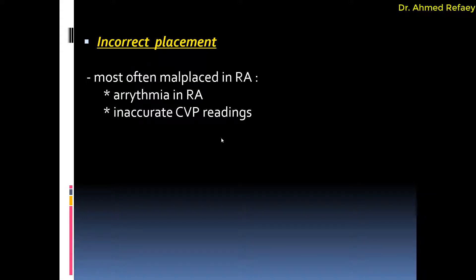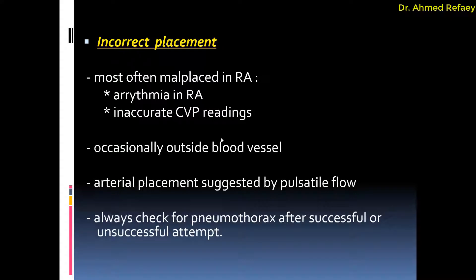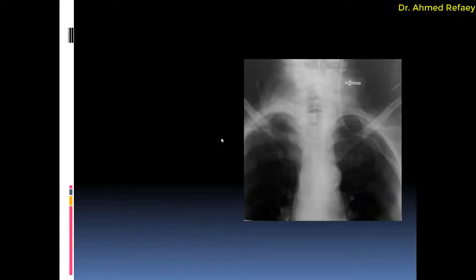Regarding incorrect placement of the central venous catheter: it is most often malpositioned in the right atrium, which can cause arrhythmia as well as inaccurate central venous pressure readings. Occasionally it is inserted outside the blood vessels. You can suspect arterial placement when you have pulsatile flow, in addition to an oblique direction of the catheter not parallel to the spine. This is an example of malpositioning — inserted through the left internal jugular vein, malpositioned in the left subclavian extending to the left axillary vein.